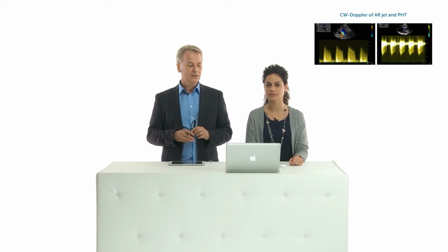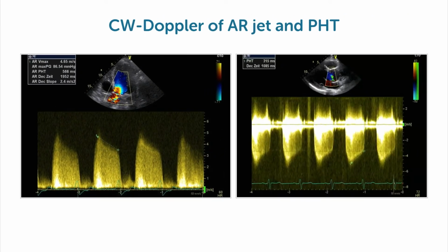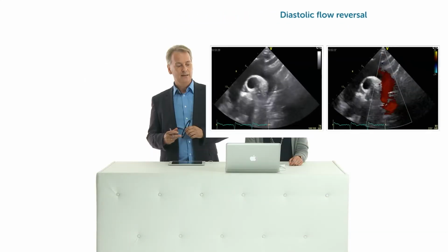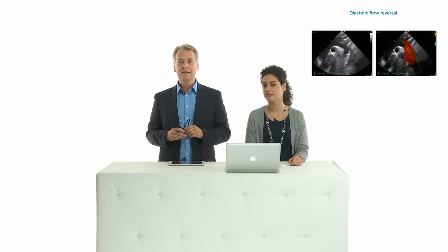And of course there are a number of different other features that you can look at in aortic regurgitation. We're again not going to go into details here in this course. The shape of the spectrum of aortic regurgitation plays a role, and also what we call the retrograde flow that comes from the aorta back into the left ventricle, which can be assessed by a view which is called the suprasternal view. We just want to show you this view because I think this method is a very important one, and even though it's something which is only more for the experienced user, I think at least you should have seen how it works. And as the name says, we're imaging from above the sternum.